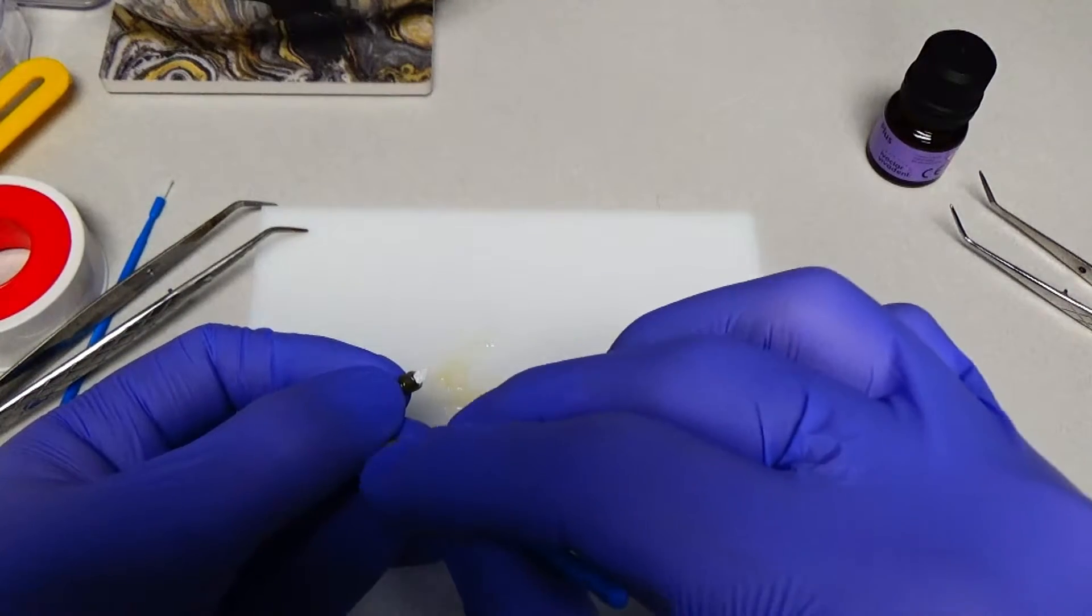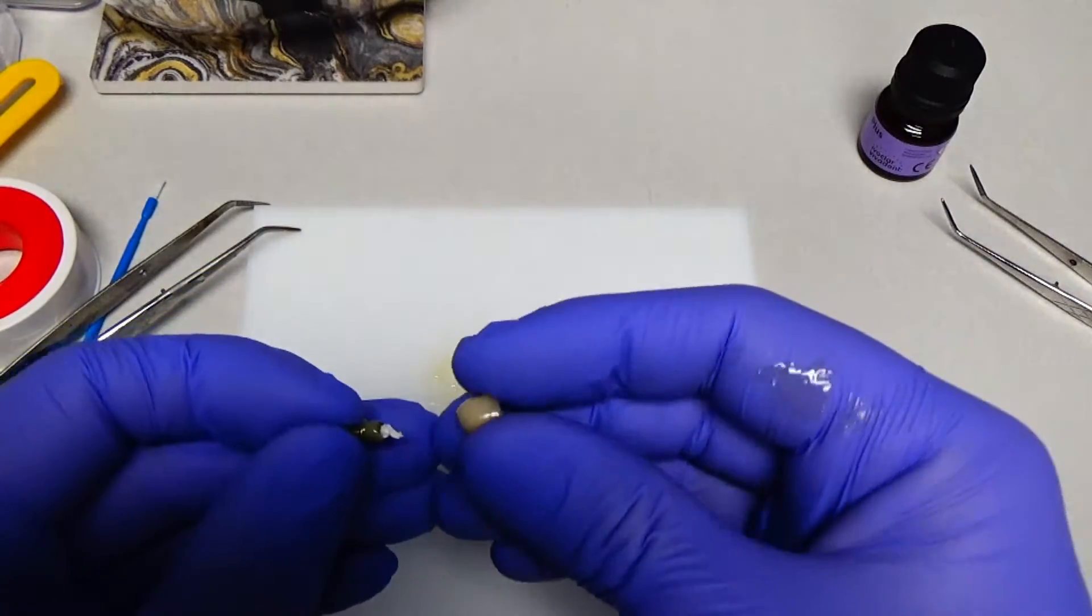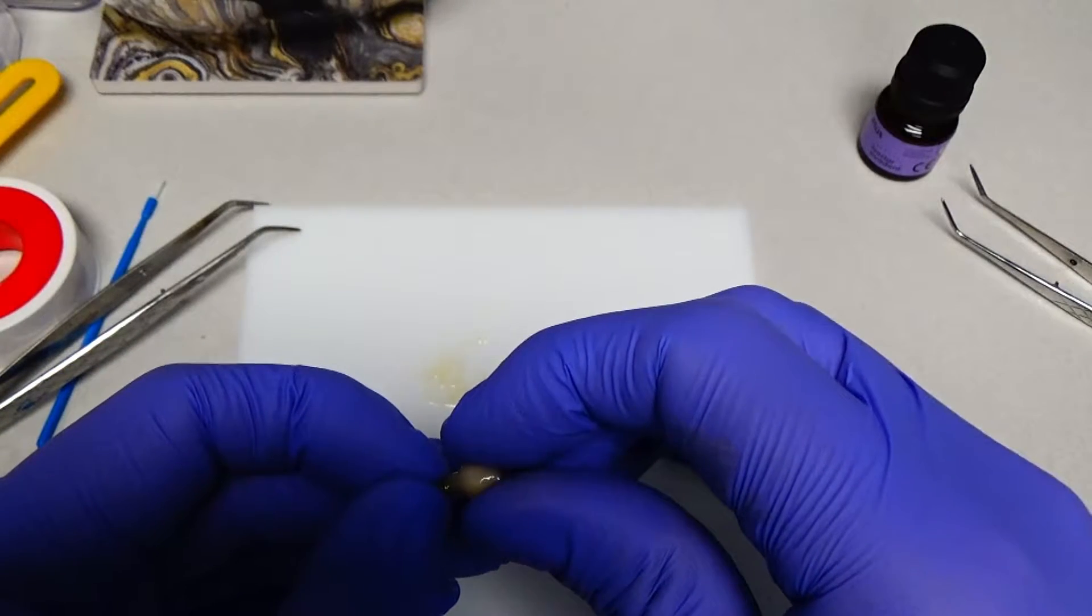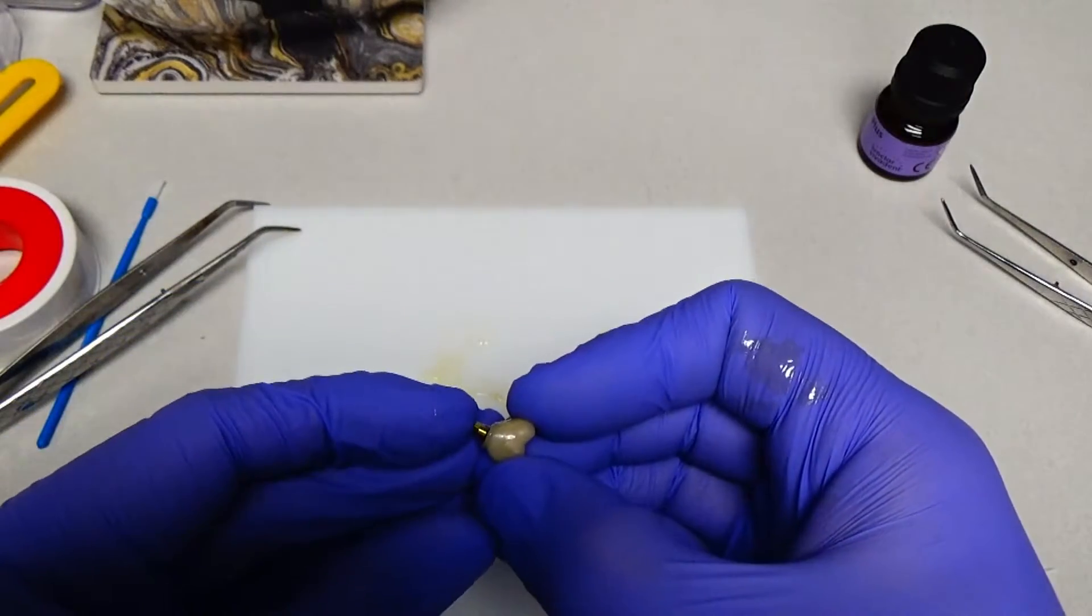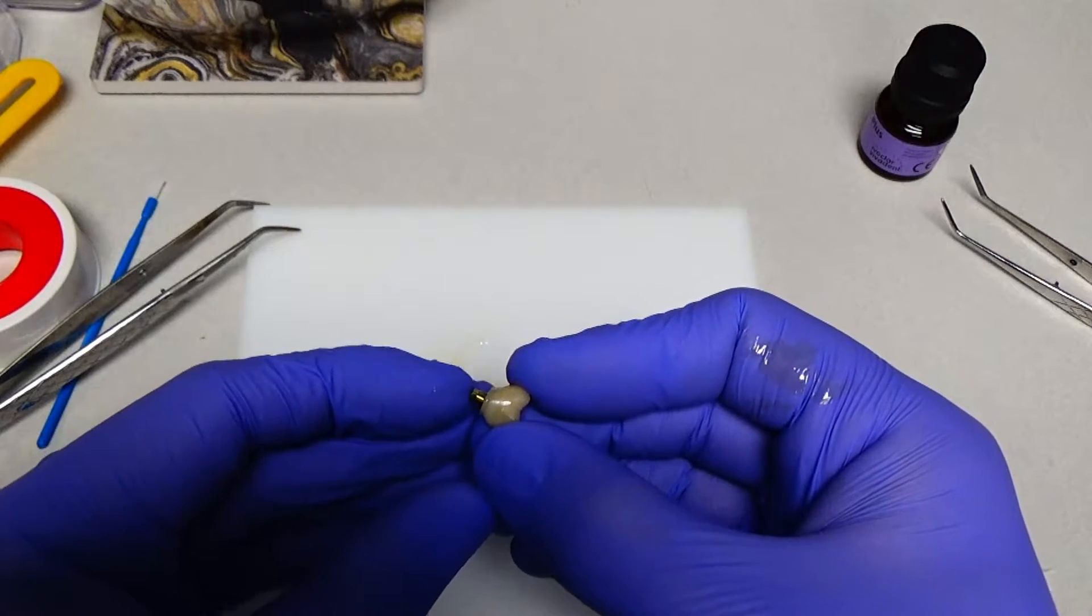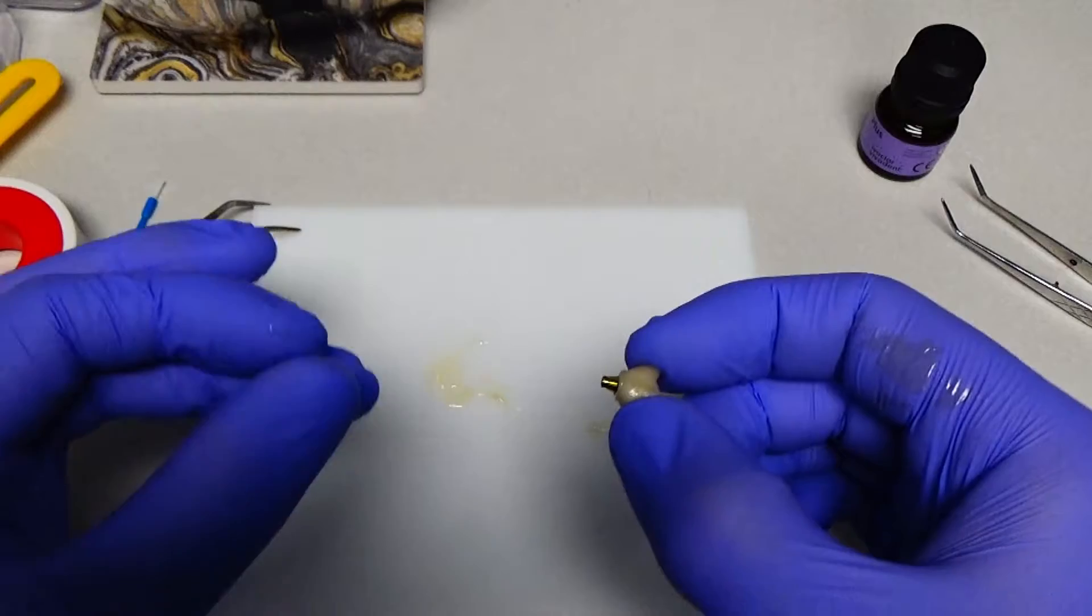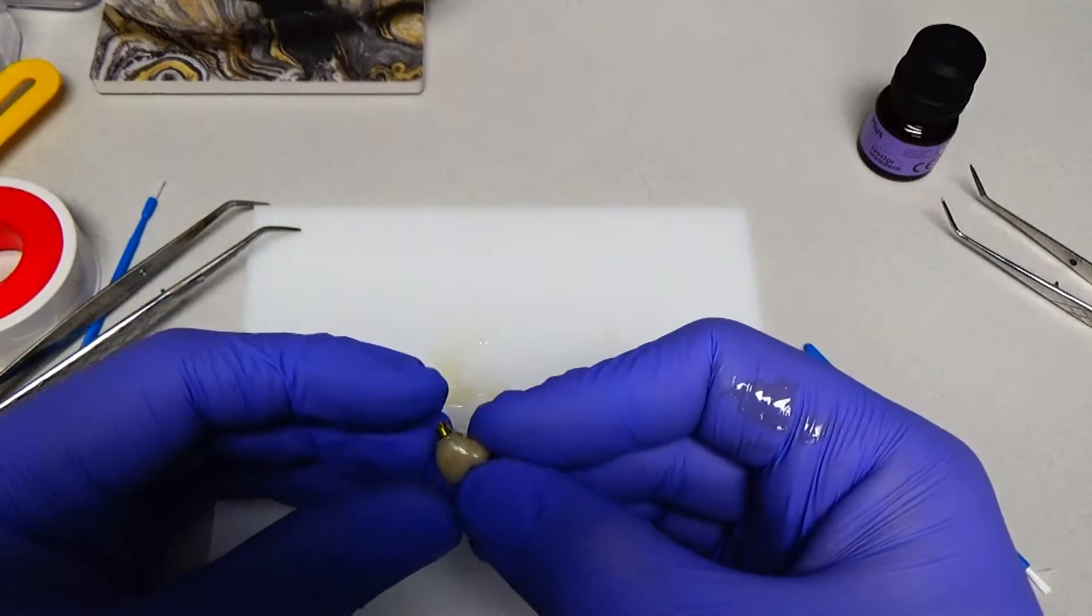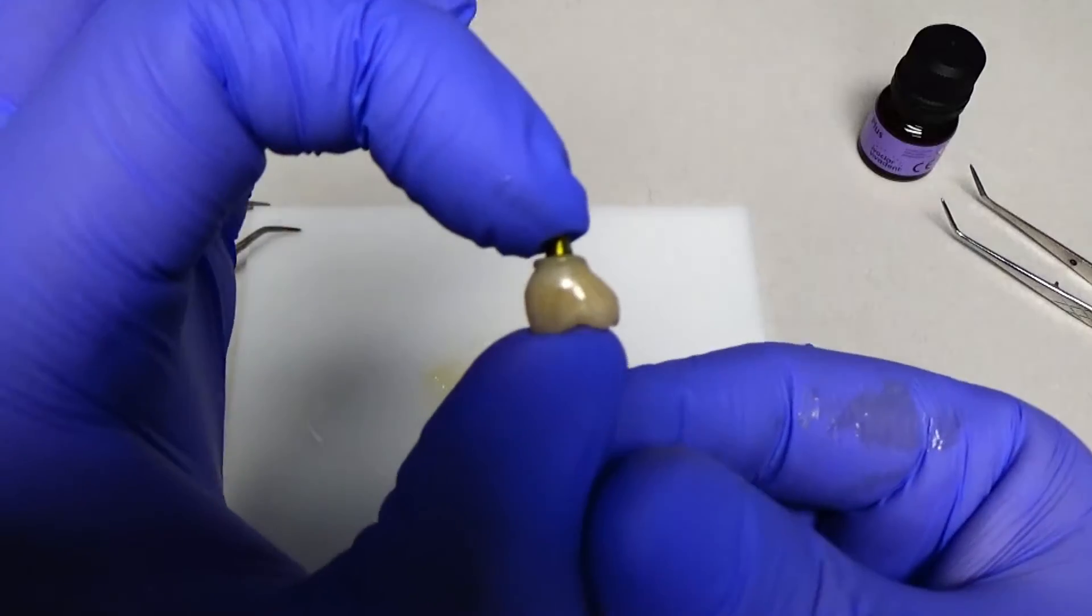One big error that I see often from the laboratory is they don't air abrade these titanium inserts as they should. And that's a huge problem that's more common than you'd think. And that's usually what happens to these crowns whenever they are in the mouth for a couple of weeks or something. And then they come back and they'll pop off and the titanium insert, you can tell it wasn't air braided because it's completely shiny. So a properly air braided titanium insert should have kind of a matte finish and it just adheres a lot better that way. So you can see here we have a lot of flash.